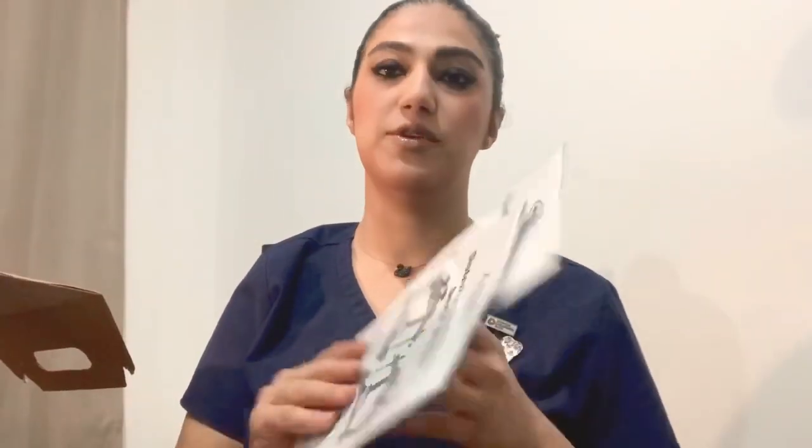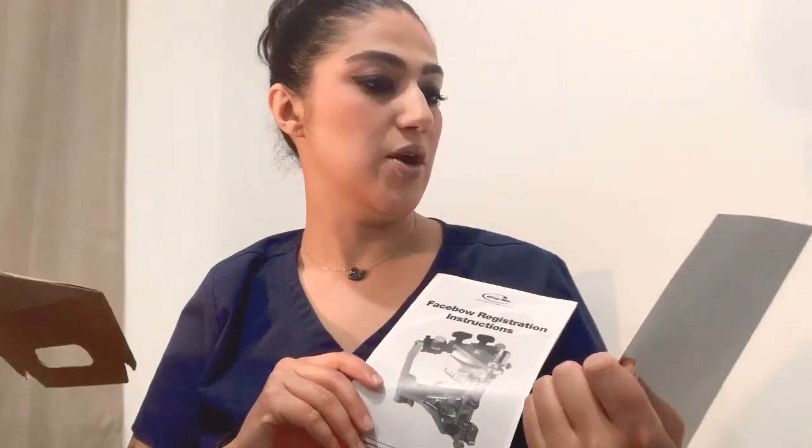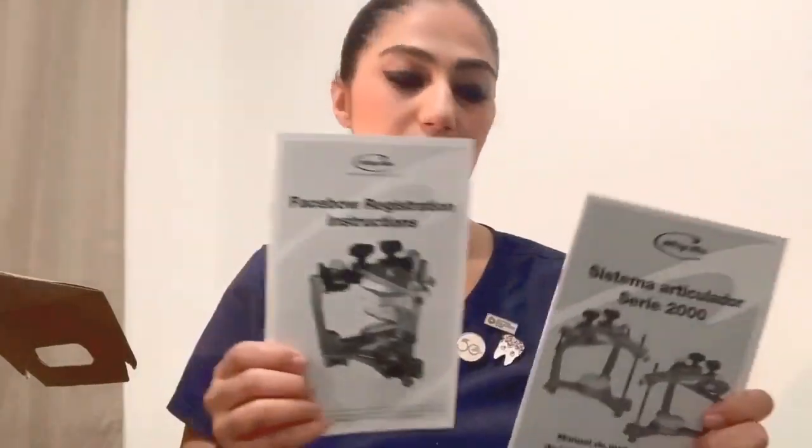It's a pretty nice box. You can see here there are instructions — there are two instruction booklets for the Whip Mix: one of them is about the articulator and the other one is about the facebow.